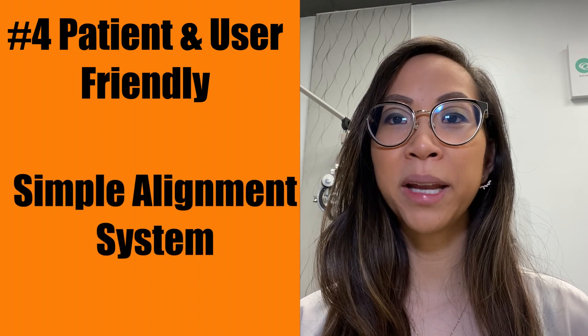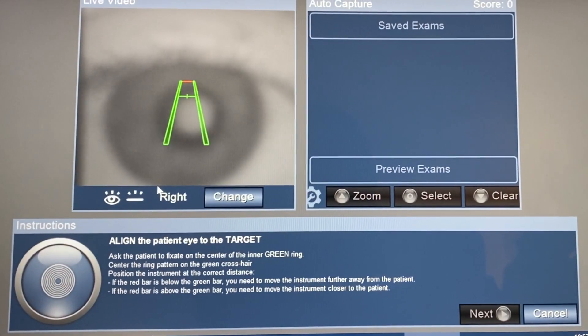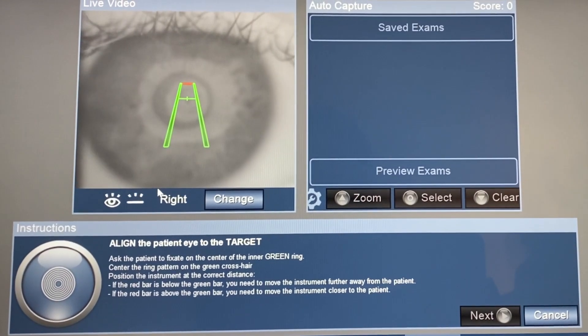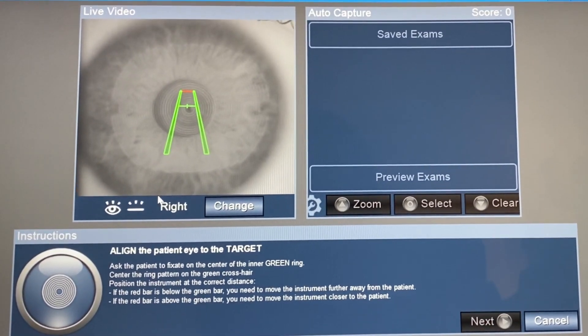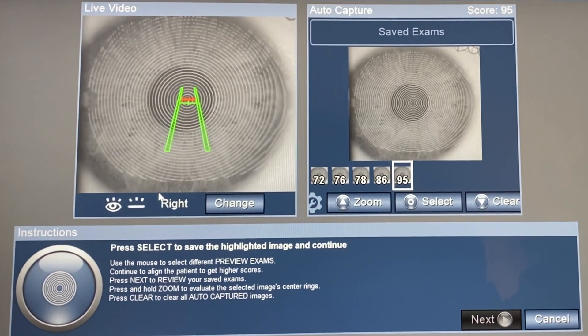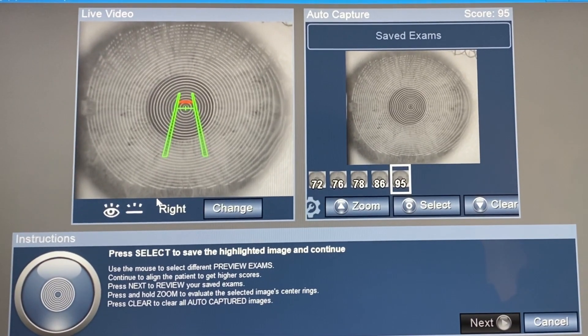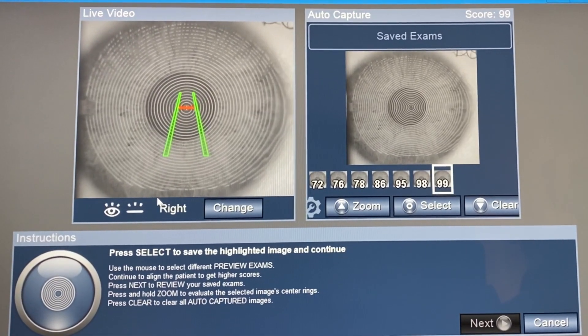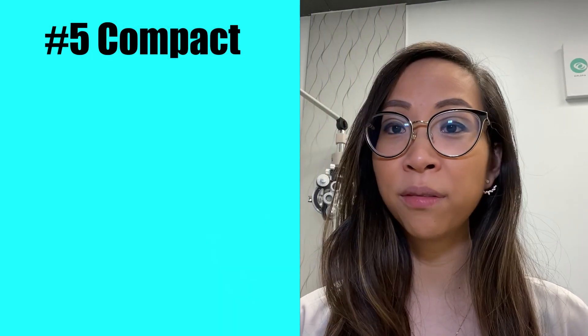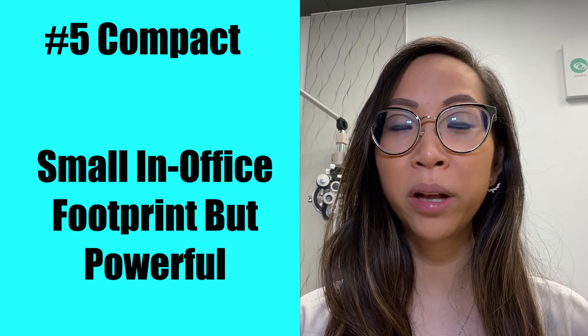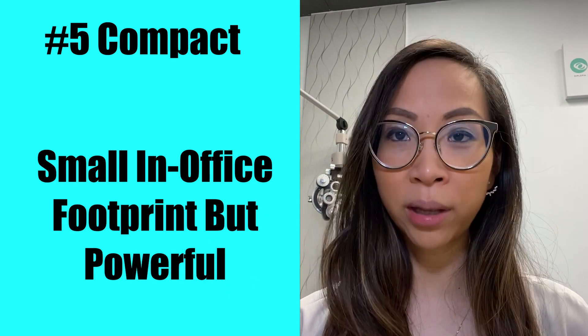The Medmont E300 was very well thought out for both operator ease and patient comfort. It uses a simple alignment system where maps are automatically captured when aligned correctly, and data is obtained quickly in just seconds. For the patient, it may seem a little daunting because the cone comes pretty close to the eye; however, it just cups the eye and never touches it. The red rings may be a little bright and psychedelic for some, but it is entirely safe. The instrument itself is also compact with a very small footprint, while maintaining great performance and reliability.